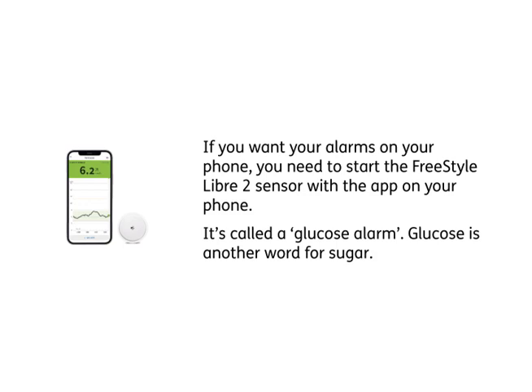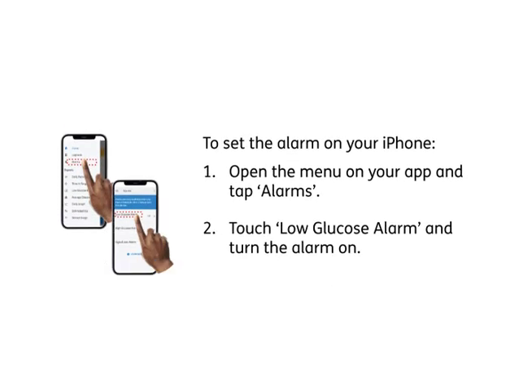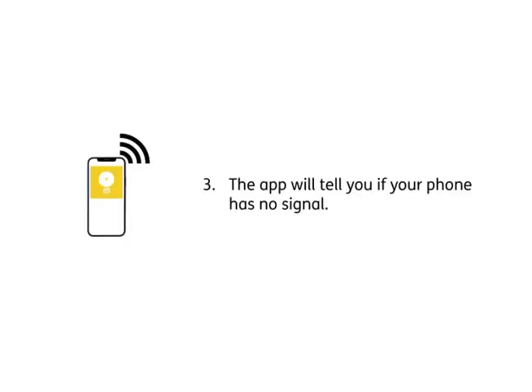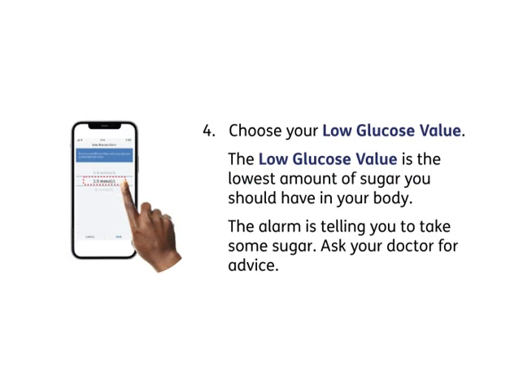Glucose is another word for sugar. To set the alarm on your iPhone: 1. Open the menu on your app and tap Alarms. 2. Touch Low Glucose Alarm and turn the alarm on. 3. The app will tell you if your phone has no signal. 4. Choose your low glucose value. The low glucose value is the lowest amount of sugar you should have in your body. The alarm is telling you to take some sugar. Ask your doctor for advice.